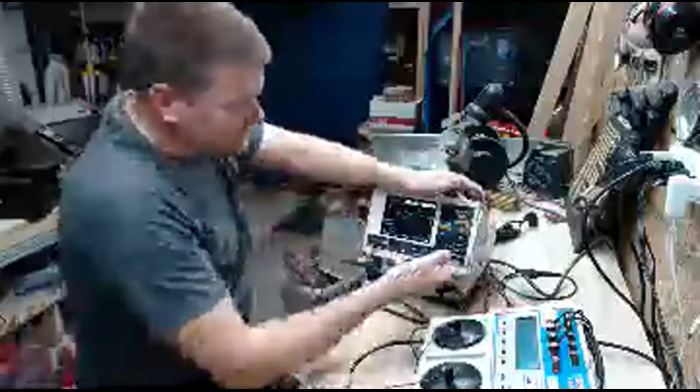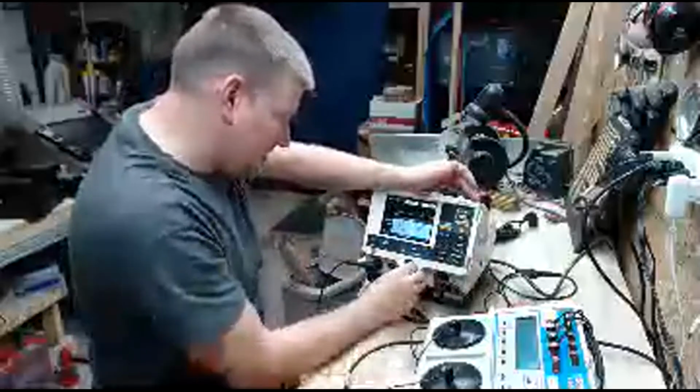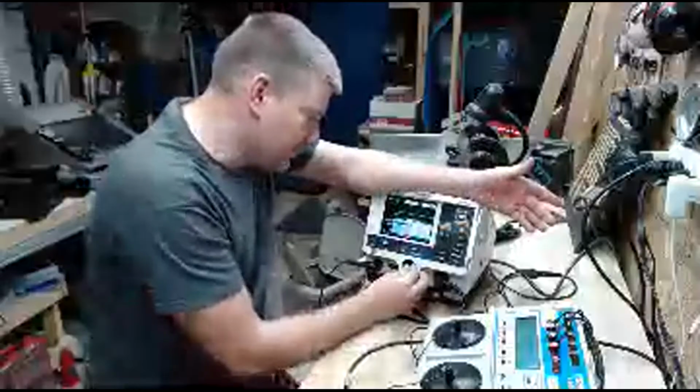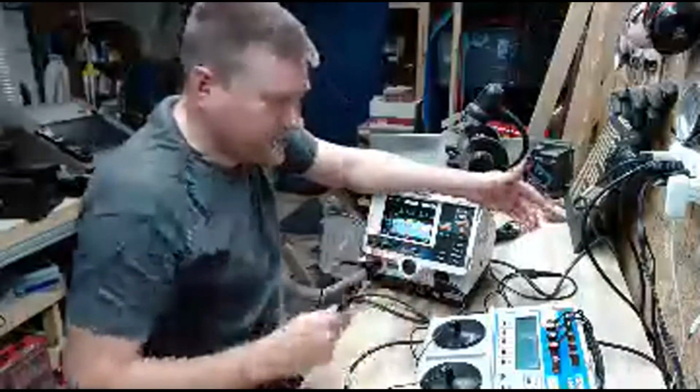And this one does not have async mode. I think it's in the menus though. Pacing, demand. Yeah, so okay, here they call it demand mode. So there's demand and not demand.